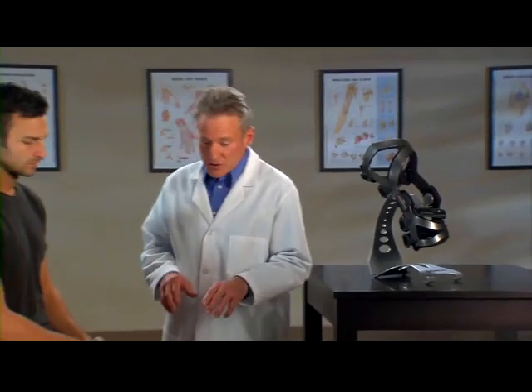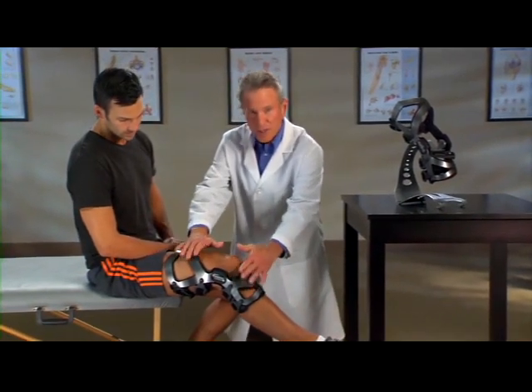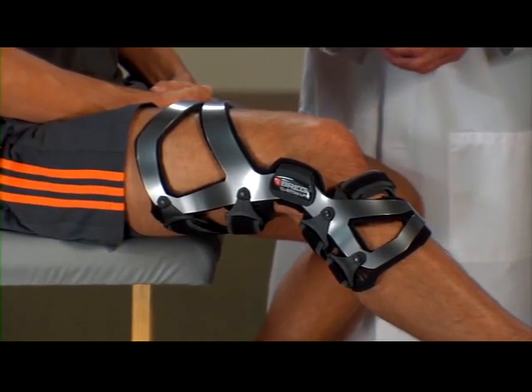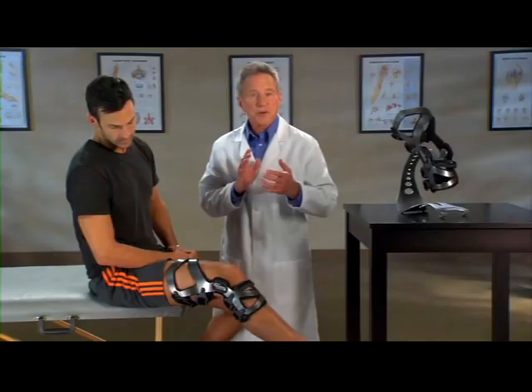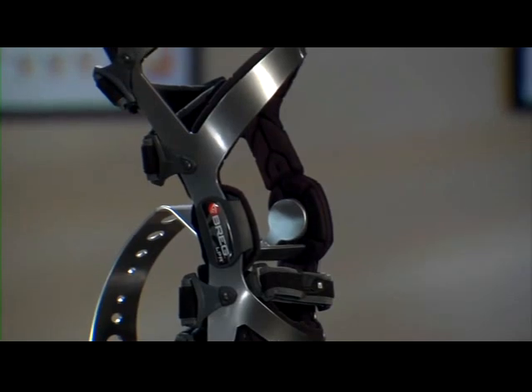Here's why. First, there's the brace frame. You can see how it's contoured to hug the leg — no gapping or pinching. The brace's truss frame, these angles here, provide structural stiffness and strength. The frame is actually made from aerospace aluminum, making it strong yet lightweight.